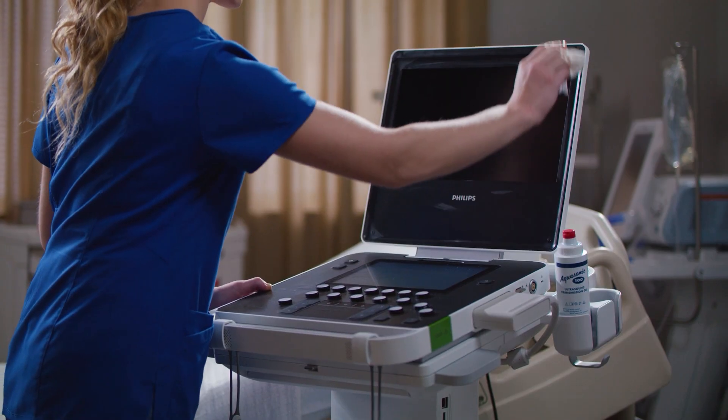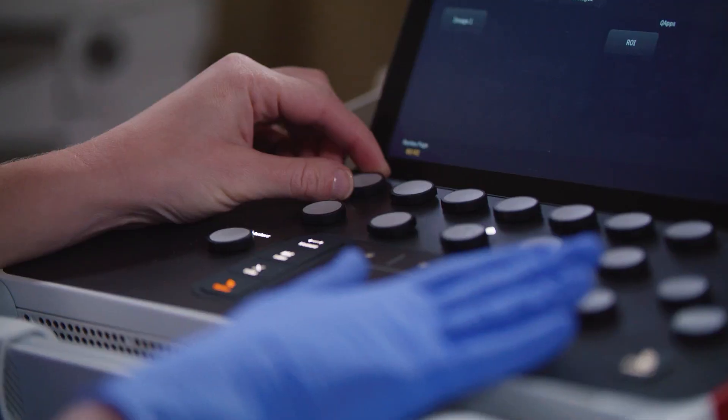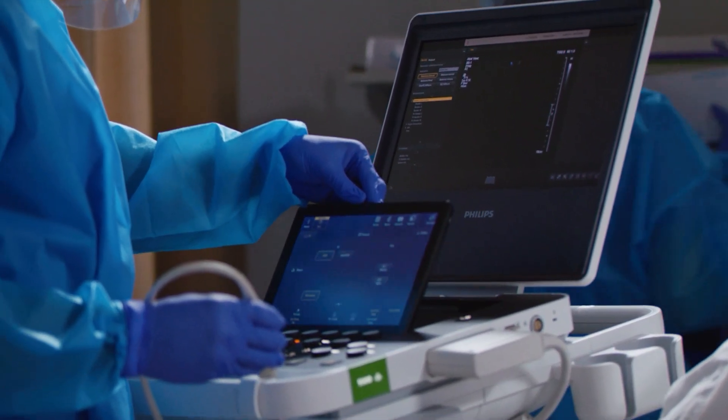The Compact 5000 Series features a cleanable surface and easy-to-access controls in the main panel, ultimately allowing for walk-up usability in a ready-set-go fashion.